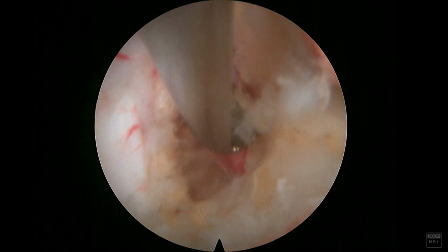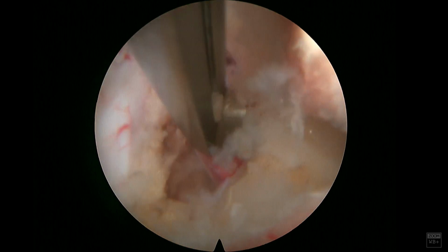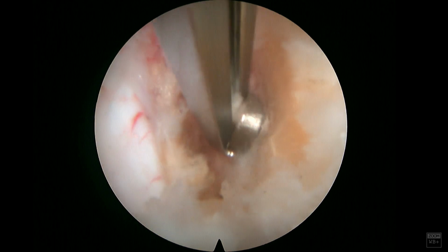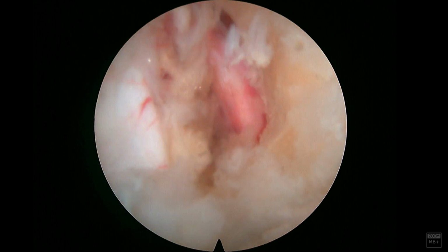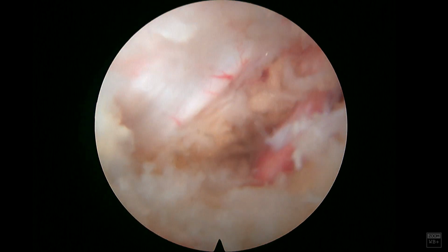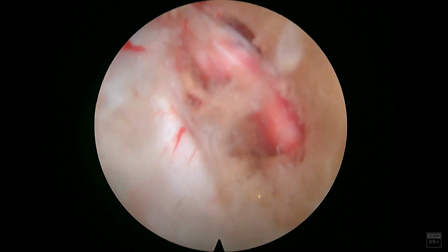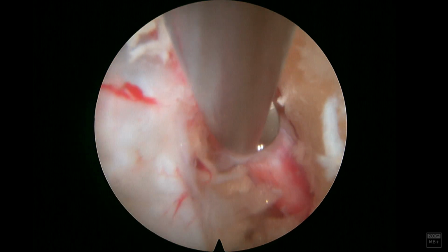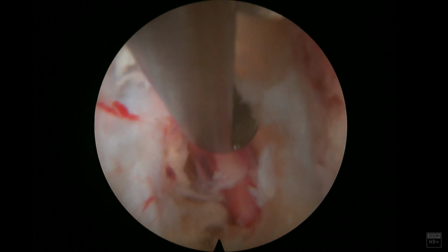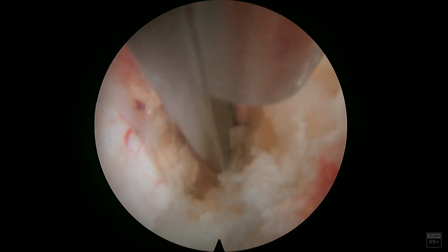And I didn't want to entertain a 2-level surgery when I could potentially just attack the traversing nerve root. I had counseled the patient that if he didn't get good relief with the endoscopic decompression of the traversing nerve root, then we could move forward with that 360. But at least I would be able to provide the decompression of a 2-level surgery endoscopically first, allow him to heal from that, see what his symptoms are, and then potentially go back and do a 360 later, do a large cage with indirect decompression and correct a spondylolisthesis at L5S1.